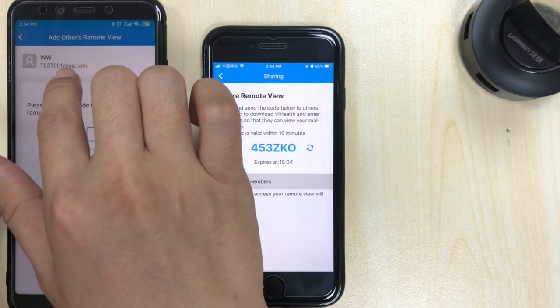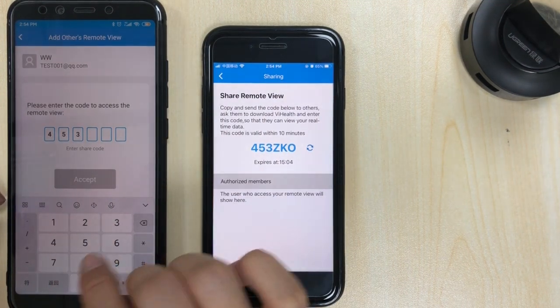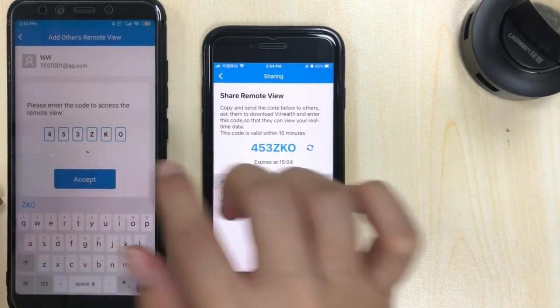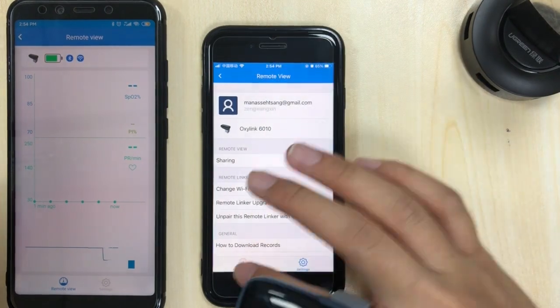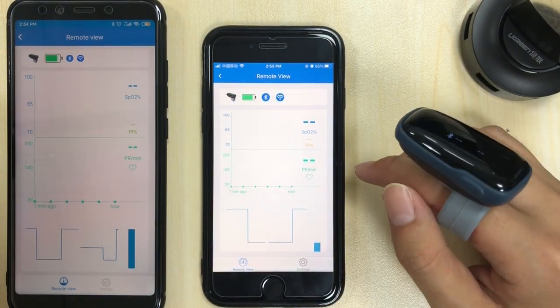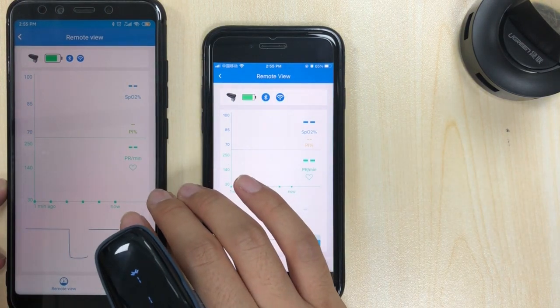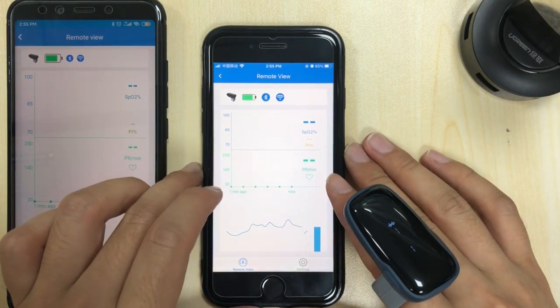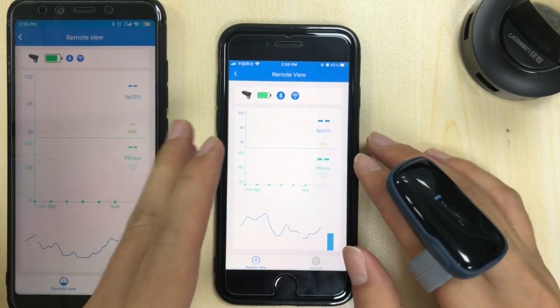You also have to log in on this phone. Now it's all set. This phone is the primary device and this one is the remote viewer.